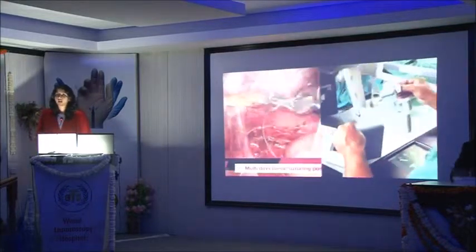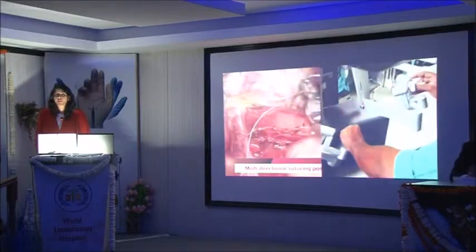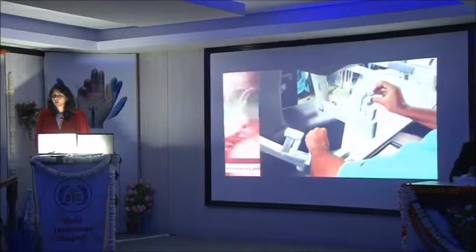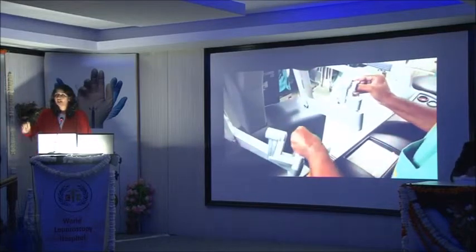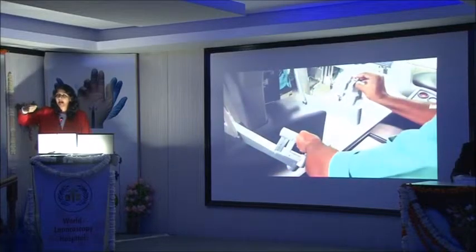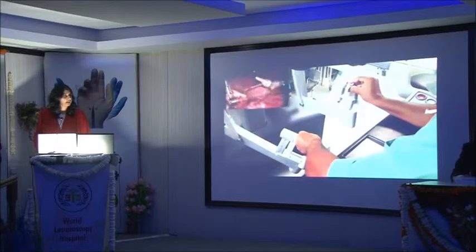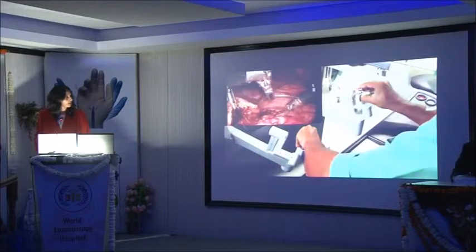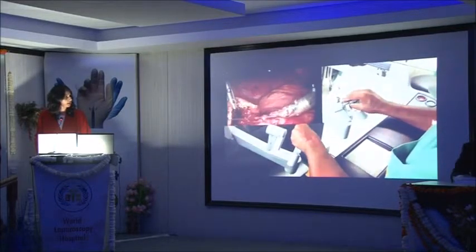Suturing is one area which robotic surgery has made really easy. For the laparoscopic surgeons who have been doing surgery for long, laparoscopic suturing is one thing they boast about, that they're doing it very efficiently. With the robot, you can actually have the real movements of the wrist, forehand, backhand, and the upper and the lower, equally efficiently. In fact, better efficiency than the open procedures with the human wrist. So this is a very short video demonstrating the suturing.